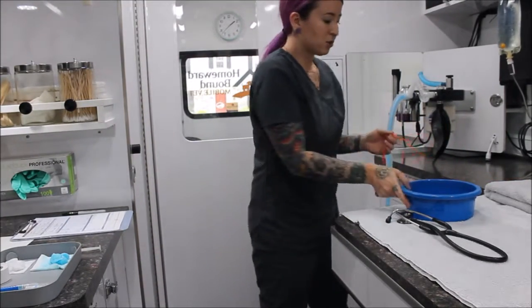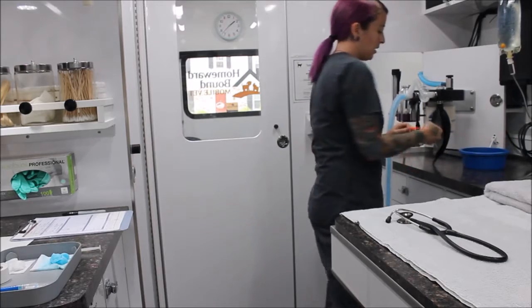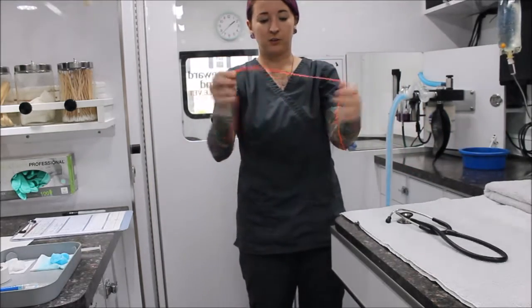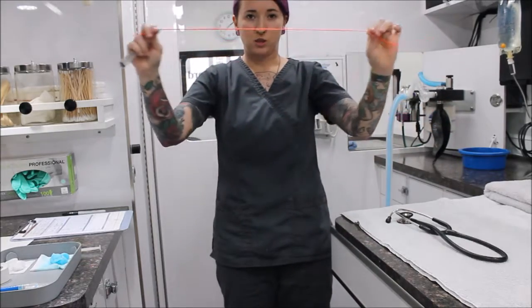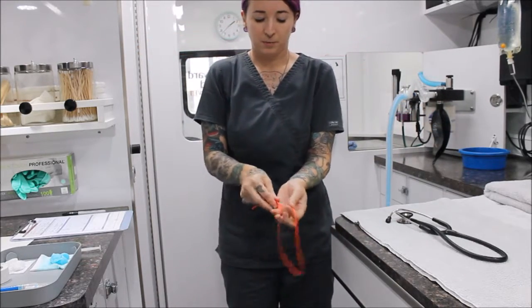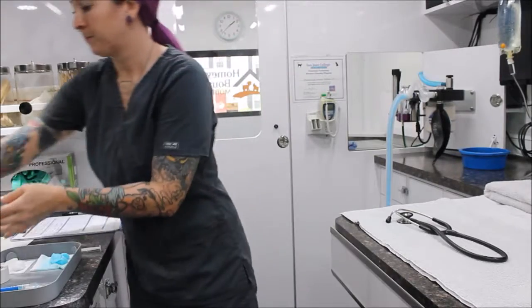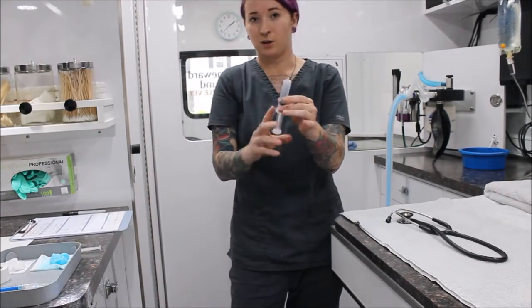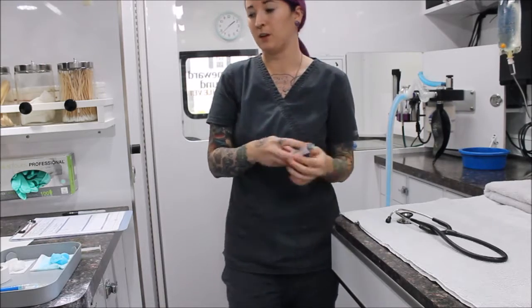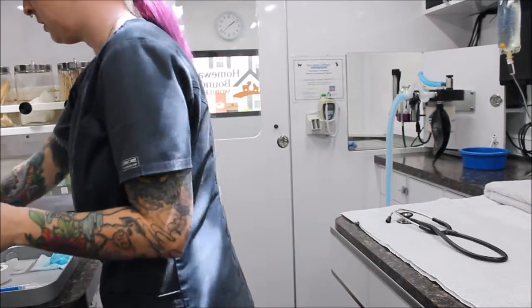Next thing I want to make sure we have is an appropriate tie for our endotracheal tubes. And this is a good length, and it also stretches a little bit, so it will be able to fit around our patient. And then the next thing I want to make sure too is that there is a syringe nearby, so we are able to inflate the cuff after induction as well.